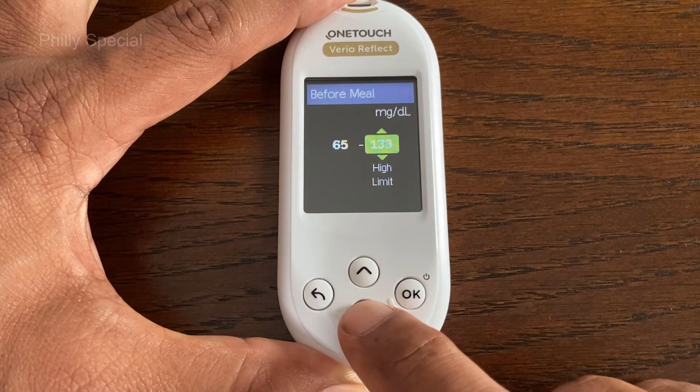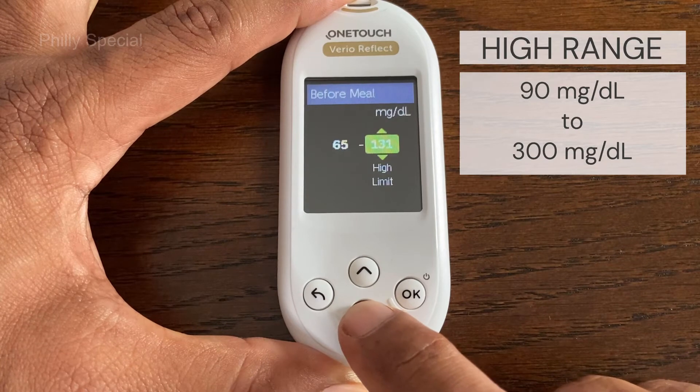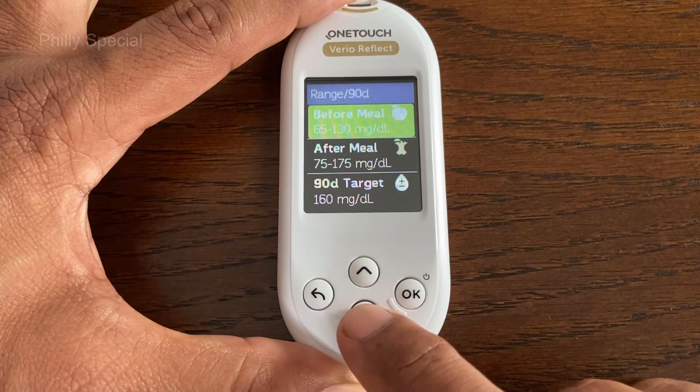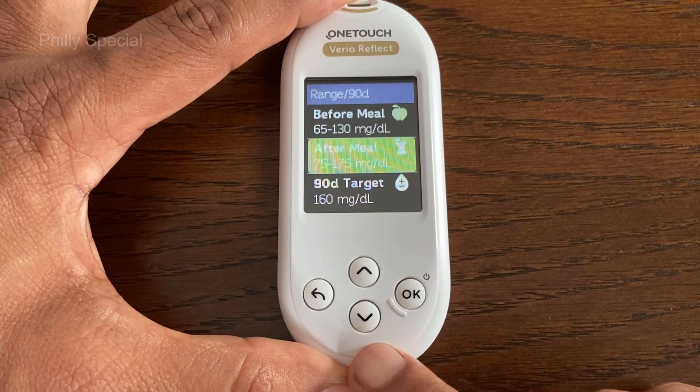Next, the current high range limit is highlighted. To edit the preset high range limit, press the up or down button to change the value between 90 mg/dL and 300 mg/dL, and then press OK to confirm.